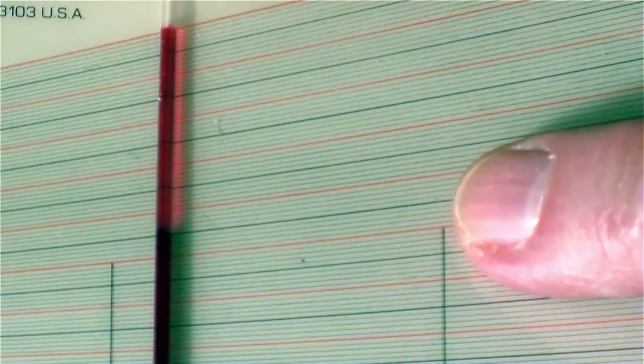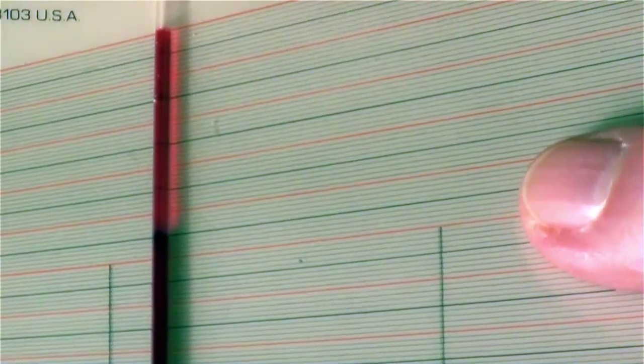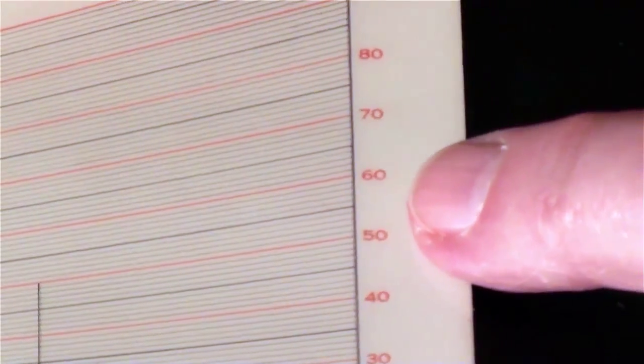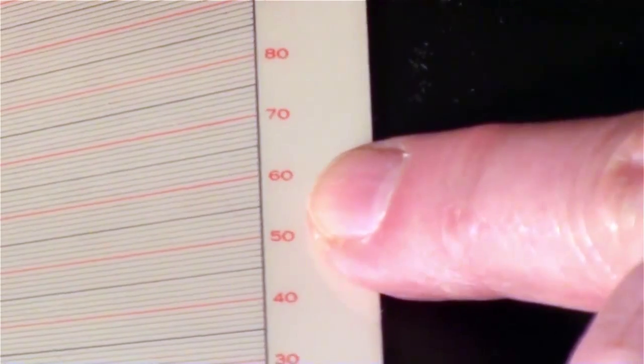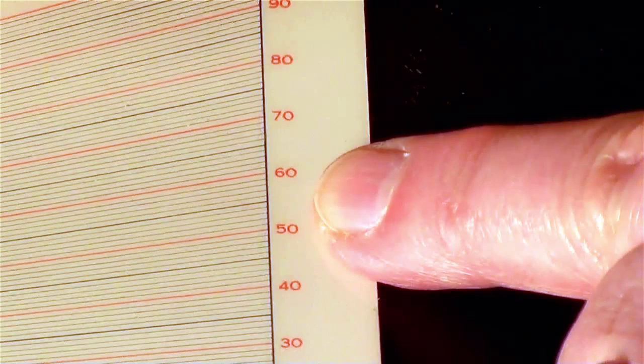If I follow it to the side, I'm going to find a number. In this case, it's 55. So that means this sample of cow blood was 55%. That's the hematocrit reading.